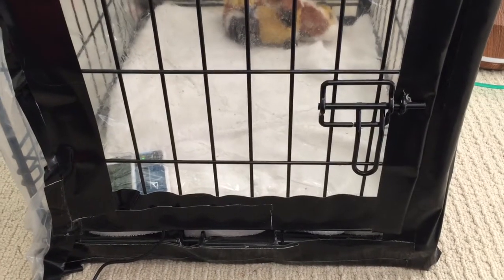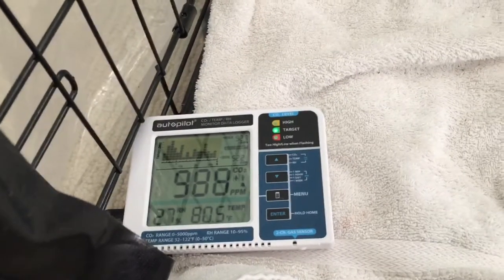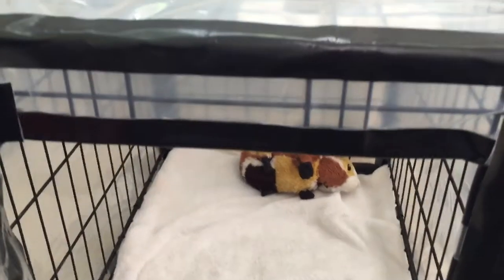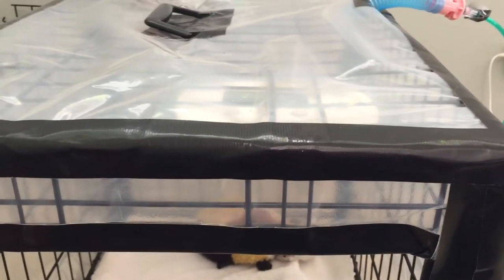If it gets too hot you can put freezer packs in there to cool down the air and your dog. This was apparently a good setup according to my vet and people online, but I noticed my dog would be a little spacey or sluggish when he came out of oxygen, even though it was helping him breathe. I thought maybe he was getting too much carbon dioxide, so I ordered a CO2 tester. After my dog had been in there for maybe five or ten minutes, it got up to about 1800 ppm. Normal outdoor air is around 400 ppm.